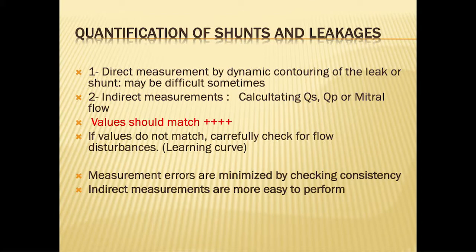We can go further now, and go for quantification, because of course with 4D flow we are able to quantify. Now the question is how to quantify flows. For me, there are two ways: direct measurement by dynamic contouring of the leak or of the shunt, but it may be difficult sometimes, because sometimes the leakage is complex, or there are two leaks, and you have some disturbance, so it's difficult.